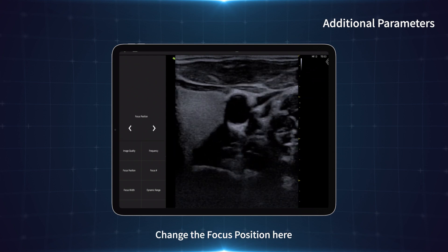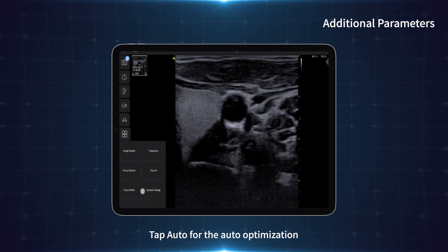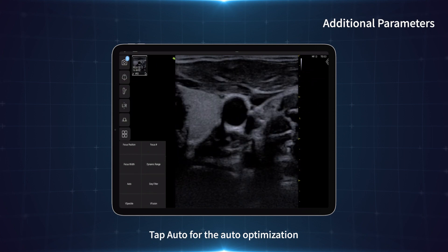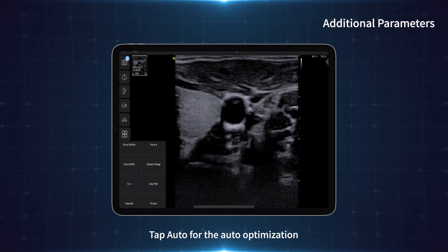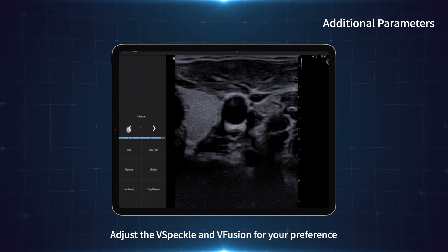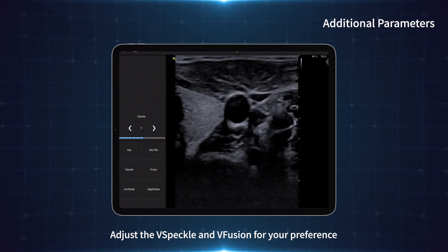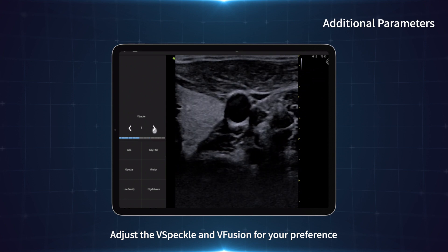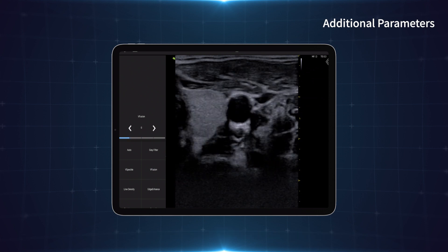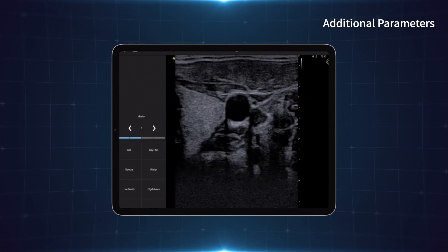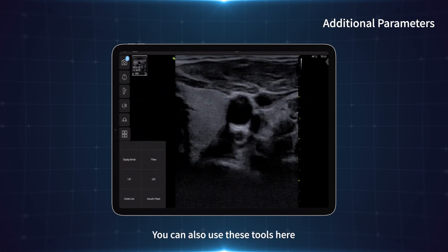Change the focus position here. Tap auto for the auto-optimization. Adjust the vSpeckle and vFusion for your preference. You can also use these tools here.